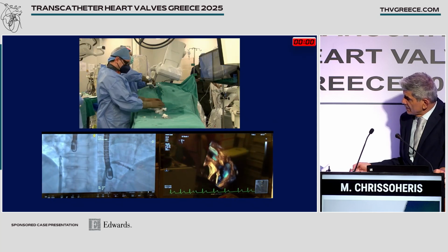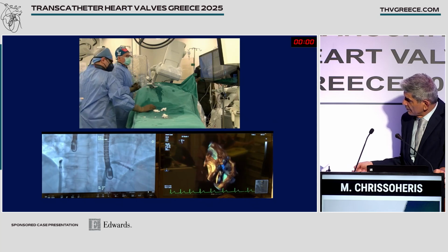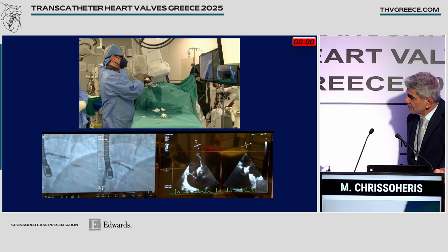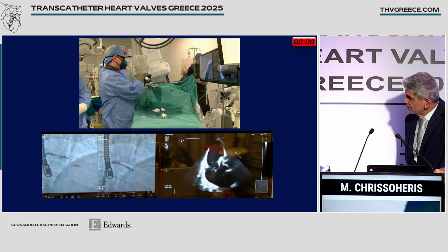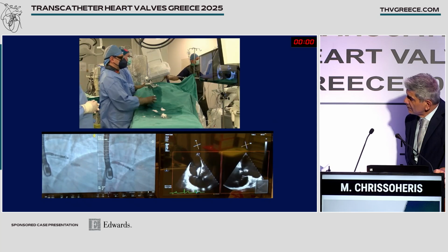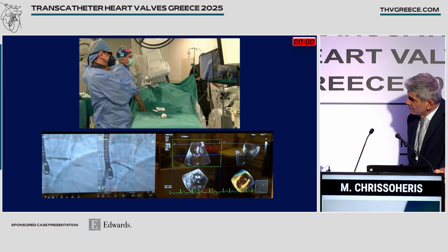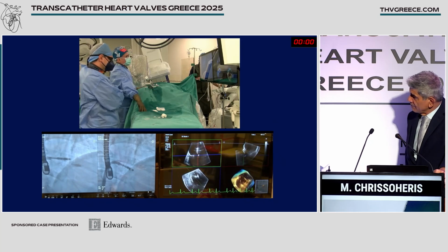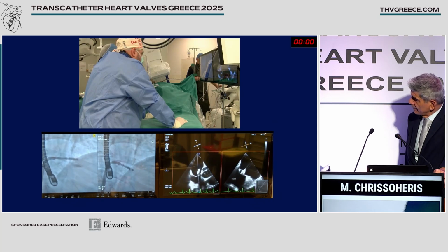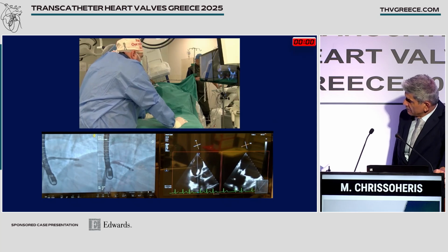So the second device comes in. This is a bicaval view in 3D, orienting now towards the valve. And again, biplane imaging for our position and trajectories. This one will move more in the interseptal area of the valve. Again, with MPR, we try to position our device as accurately as possible. We'll cross the device, with the device closed, into the right ventricle.